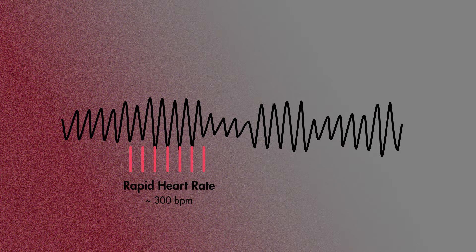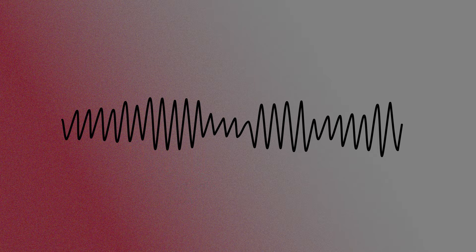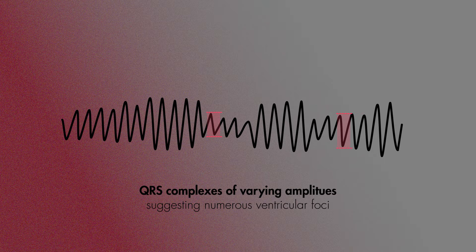Taking a look at the rhythm strip further, we notice that each of these complexes occur in rapid succession at almost a rate of 300, and there are no preceding P waves — so at least we know this is a tachycardic rhythm that isn't originating from the sinus node. Furthermore, notice how wide each of these complexes are, suggesting they are likely from a ventricular source.